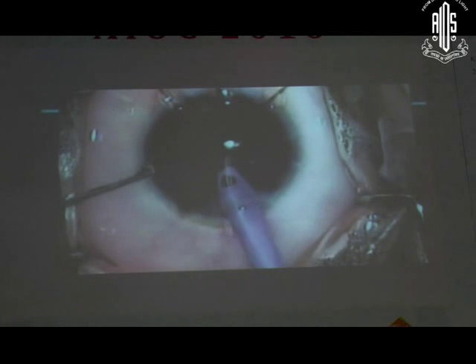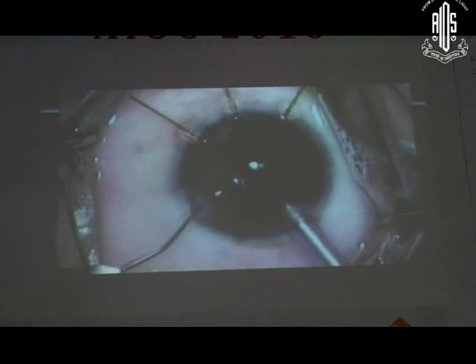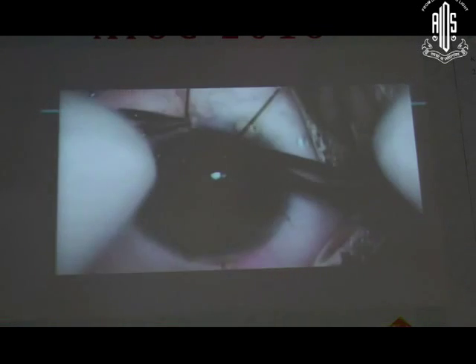Once the bag has been stabilized, a slow motion phacoemulsification can be done, and we have to keep on injecting viscoelastic each time we retract back outside the eye. Now, slow motion phacoemulsification has been advocated by Osher, in which the bottle height is lowered, the aspiration flow rate is lowered, as well as low power settings are used. Now that most of the cortex has been taken out, a coaxial IA cannula is being used, and each time we are retracting outside, we're injecting the AC with the viscoelastic.